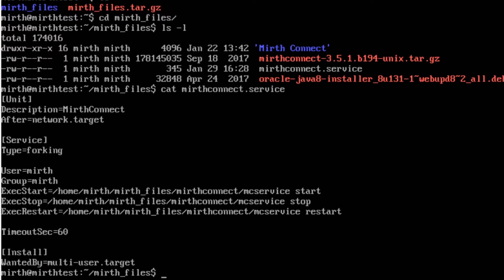If I cat MIRTH Connect dot service it will show you the contents of that file. What this is is instructions telling Linux how to start MIRTH Connect. So what we want to do is register this file with the Linux system so that it will automatically restart MIRTH Connect.